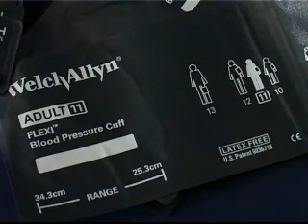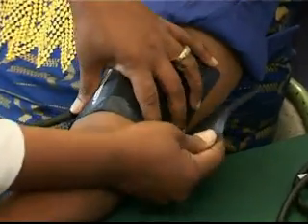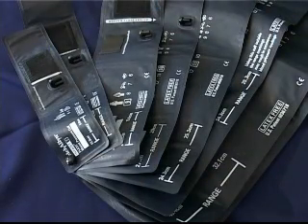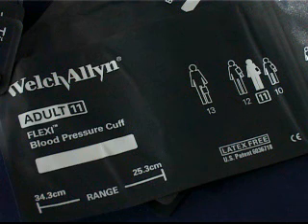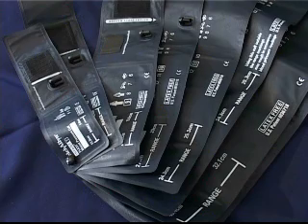Most blood pressure devices are supplied with either a standard adult or large adult cuff, or possibly both. Using the wrong cuff size for the patient's arm will result in serious errors in reading. It is therefore recommended that the following cuff sizes are available: child or small adult over the age of 14 for arms between 22 and 26 cm; adult for arms between 27 and 34 cm; large adult for arms between 35 and 44 cm; and thigh or obese adult for arms between 45 and 52 cm. These recommendations are made by the American Heart Association.